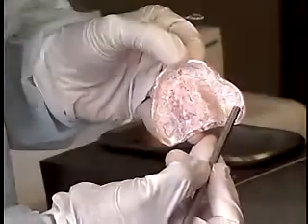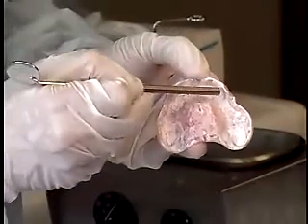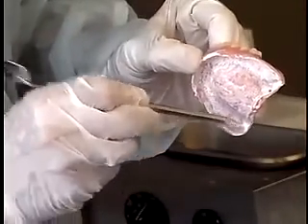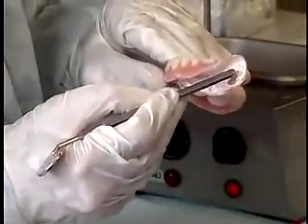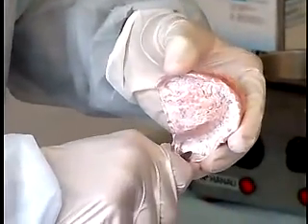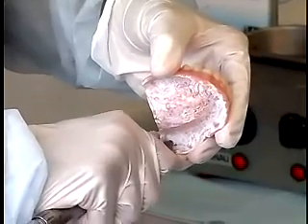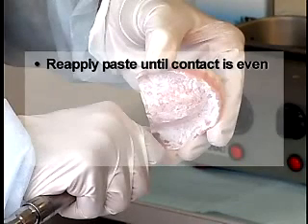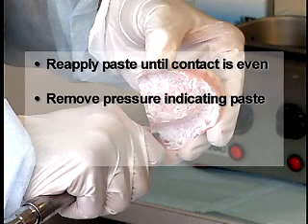Observe the areas on the tissue surface of the denture where the paste has been displaced by heavy contact with the tissue. Relieve these areas. Reapply the paste until the denture contacts the tissue surface evenly. Remove the pressure indicating paste using gauze when all tissue adjustments have been completed.